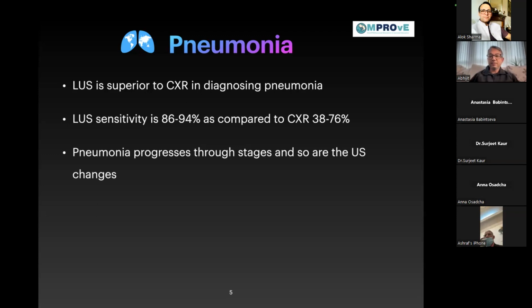As you can imagine from the graph I shared with you just now, as you start filling the alveoli or the segments of it with maybe fluids, or those areas start getting collapsed, consolidated, you keep on seeing different signs arise as the pneumonia progresses.